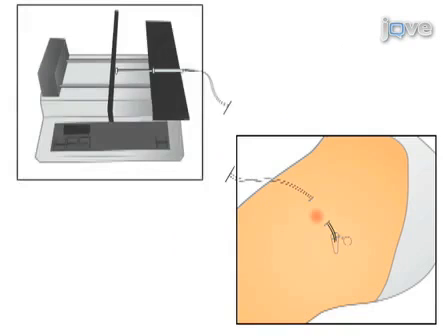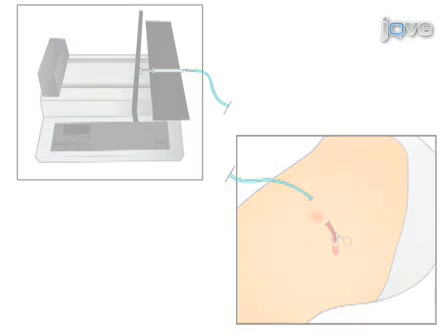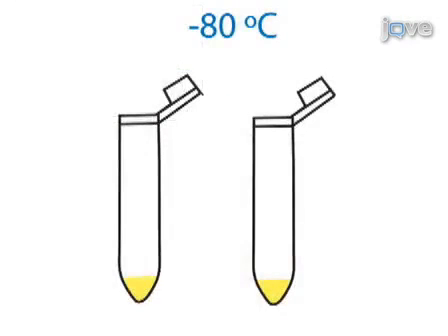A perfusion syringe is attached to the proximal end of the catheter, and the activation of the perfusion pump will induce the flow and collection of microdialysate. Following collection, samples can be stored at -80 degrees Celsius until analysis of nociceptive and inflammatory mediators is ready to be performed.